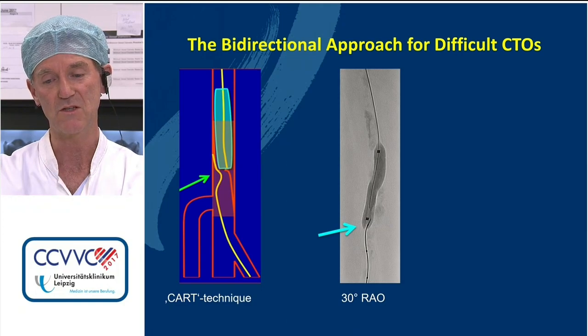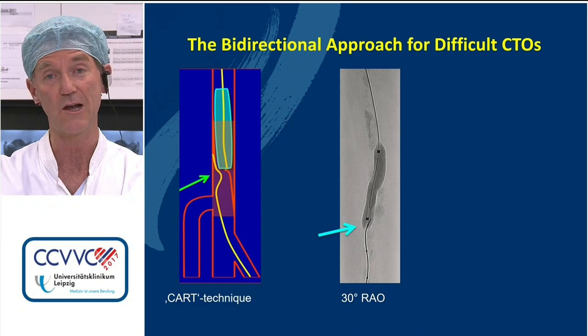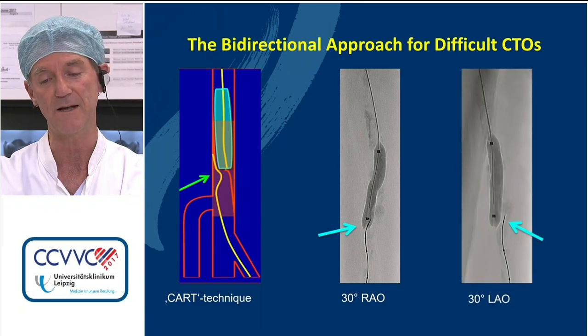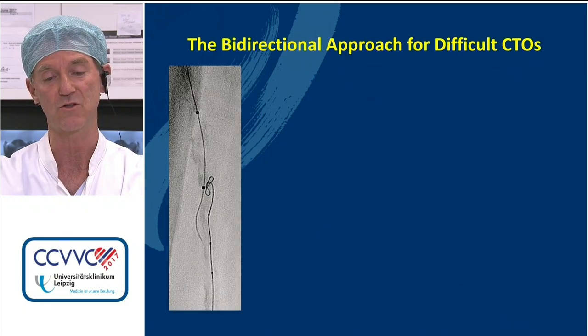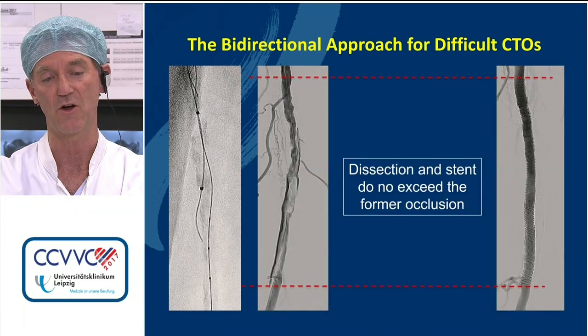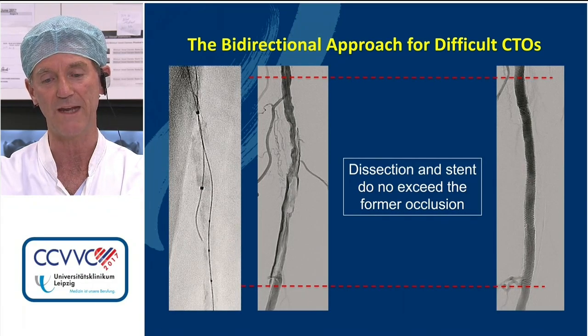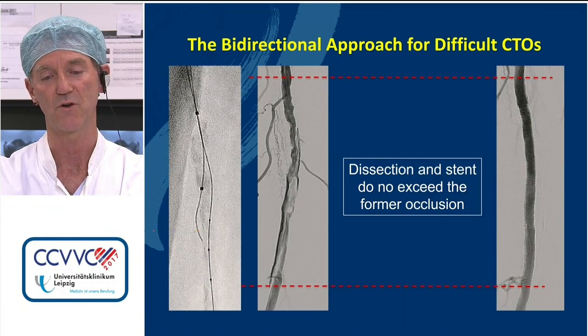We change C-arm positions to show that the wire from retrograde is relatively close to the distal balloon shoulder. You may have to do it at several levels or try to bring those wires closer to each other. But eventually, this technique really helps a lot to be very precise with what you're doing with ballooning and stenting of your artery.